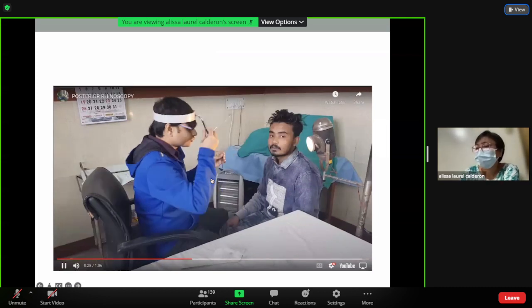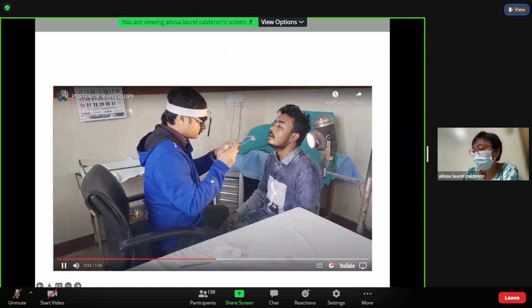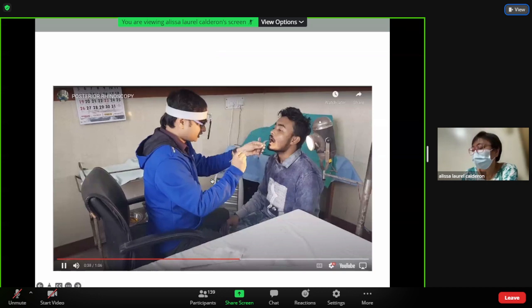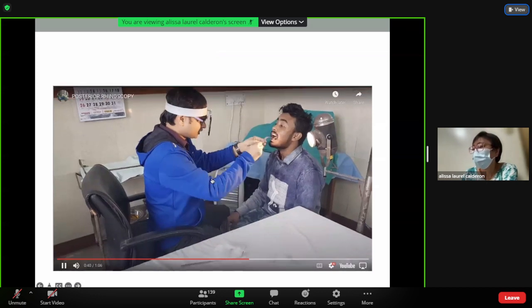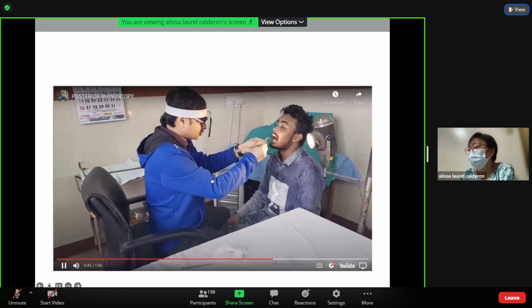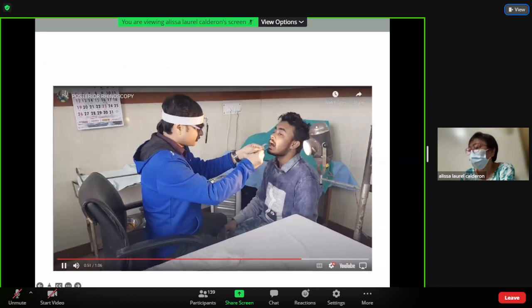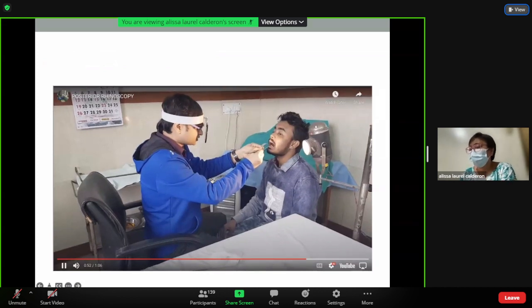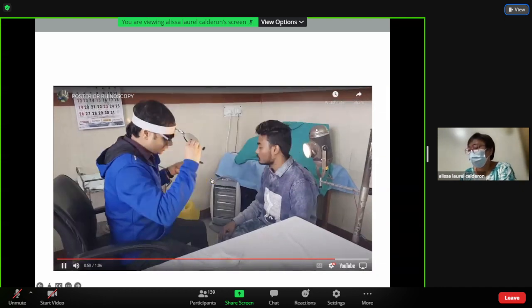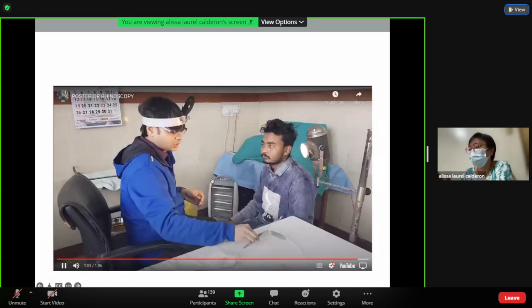Now we go for the procedure on the patient. The mirror is warmed, checked against the skin, and then introduced from the side of the oral cavity to examine the parts of the nasopharynx: the eustachian tube opening, fossa, posterior adenoids, posterior part of the choana, the posterior part of the inferior turbinate, and some part of the middle turbinate. We examine for any pathology or any abnormality in the nasopharynx. This is the whole procedure of posterior rhinoscopy.